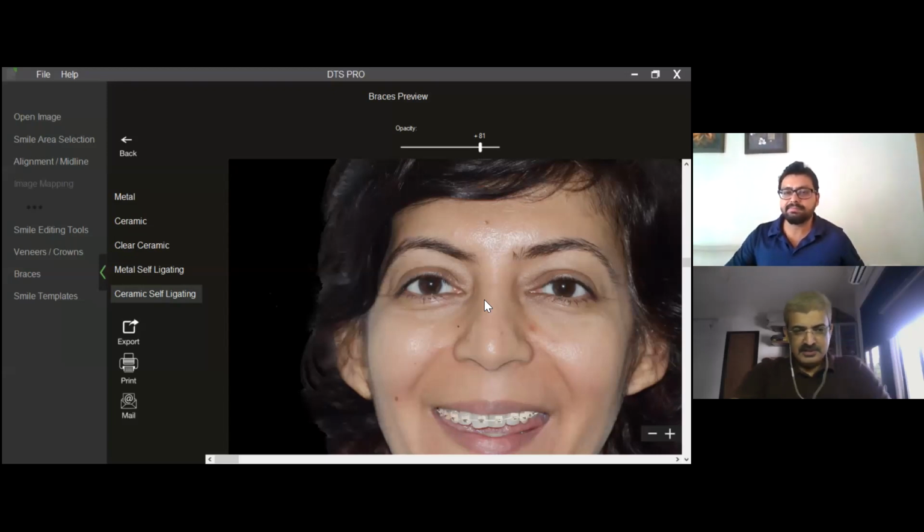Okay. Dr. Naina Patni is asking, do we require to undergo training after buying it? I think it would be through remote. Yeah, there are online tutorials available. I would not say you will start using the software the moment you purchase it and start putting in photographs. Anything does have a little bit of a learning curve associated with it. Having said that, if you do it on a couple of cases and know the tools of the software, it is more or less a very easy to use and quick software.